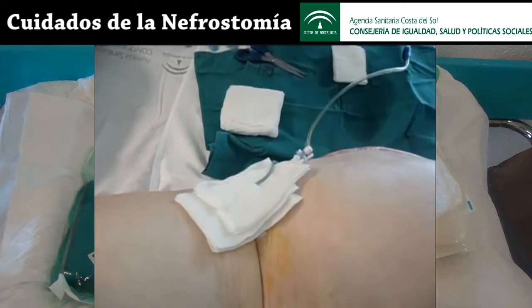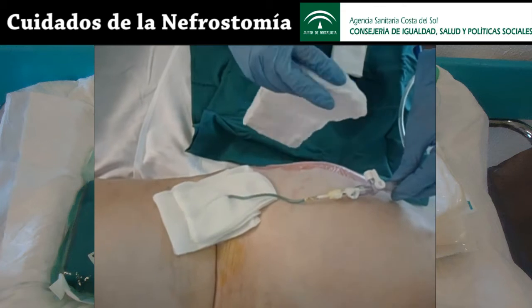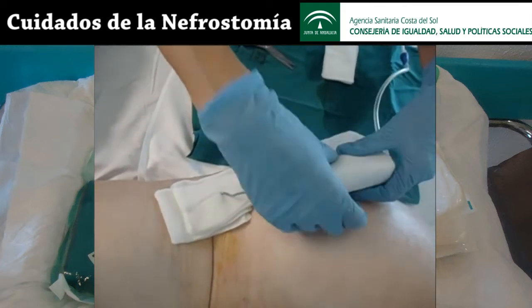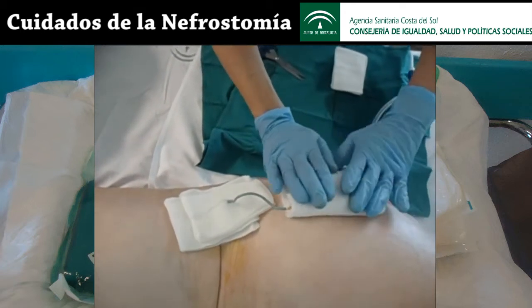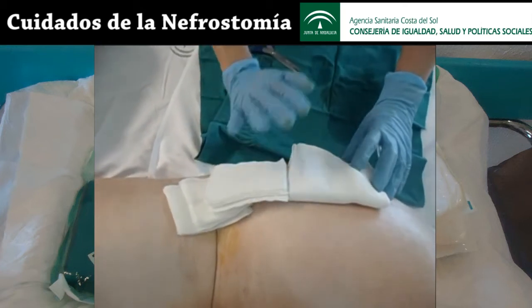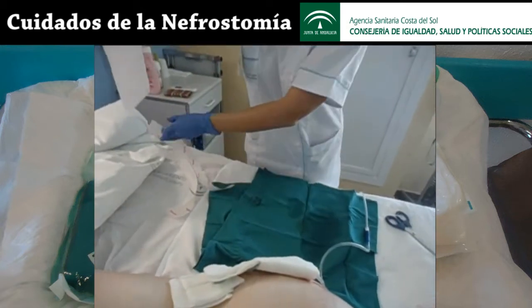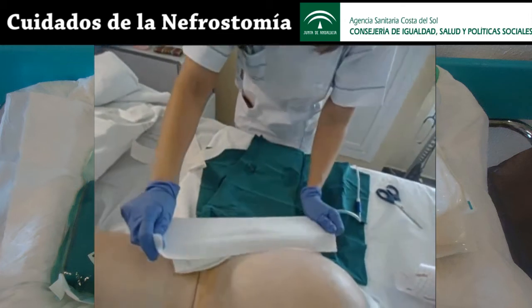The three-way stopcock can be wrapped with a pad to make it more comfortable for the patient. Finally, place the dressing.